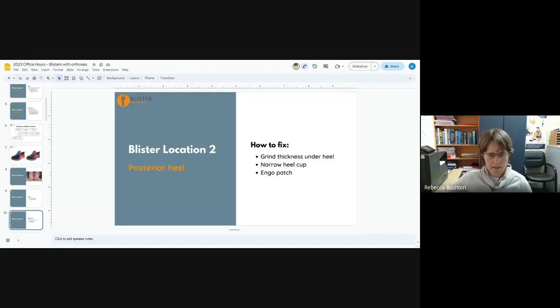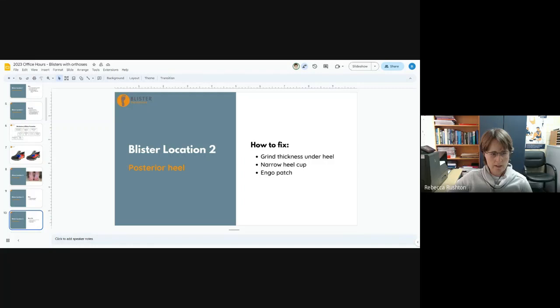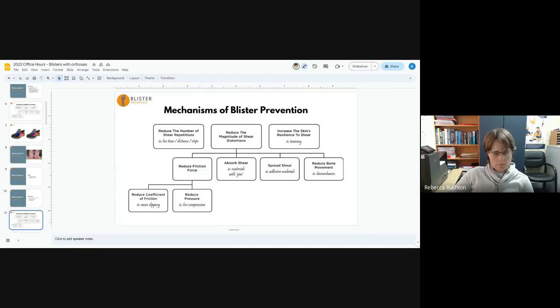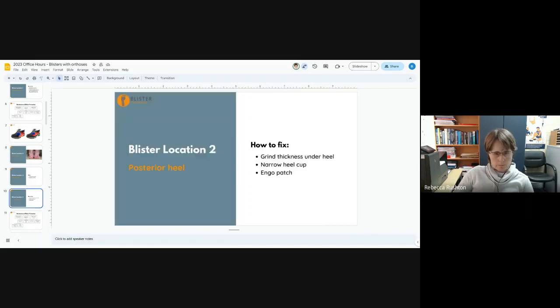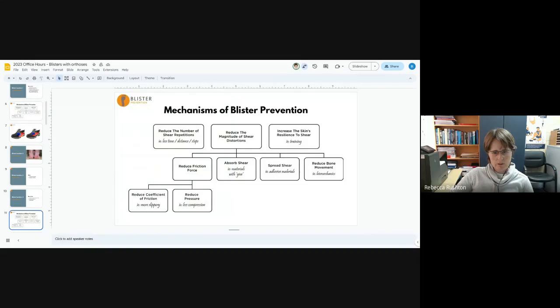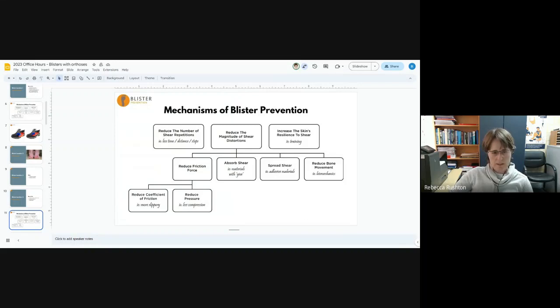We can grind out underneath, but we can also grind a bit more of a bevel on there so the orthotic sits down into the heel cup a bit better, and we can use an Engo patch just to reduce the friction level. We're reducing the bone movement by keeping the heel down in the shoe and reducing pressure by keeping it in the appropriate part of the heel counter of the shoe.